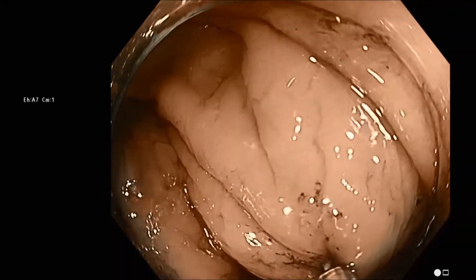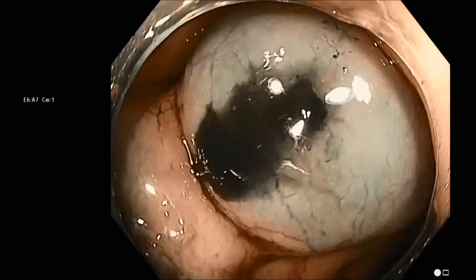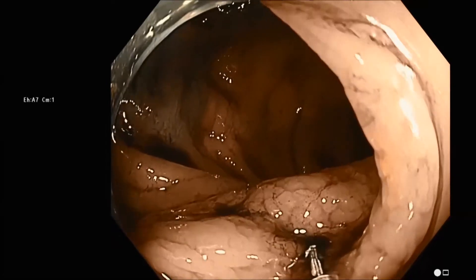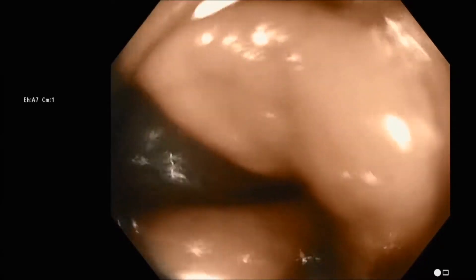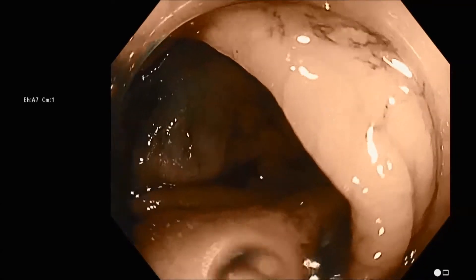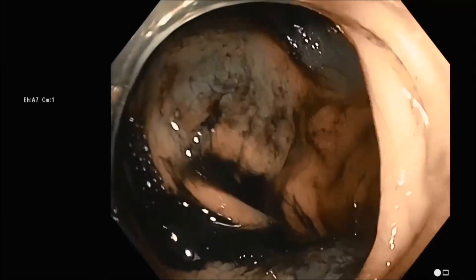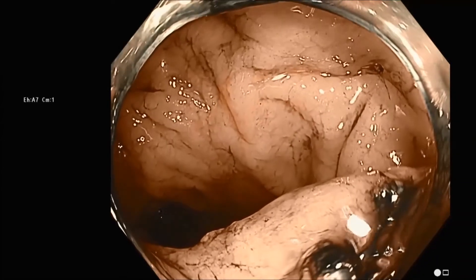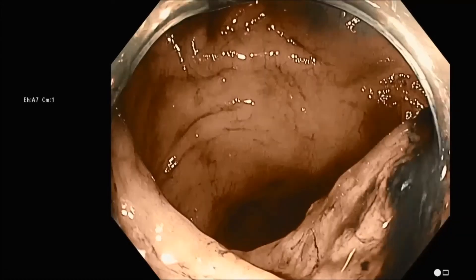Once we're finished we will take a photograph of the tattoos — hopefully the tumor will be visible. We're now going back to our initial saline blebs and getting back into those to put 1 cc of Spot into each. We're going to document that we have injected 4 mLs of Spot in four quadrants immediately distal to the tumor. That will be all the documentation needed to make sure the correct segment including the tumor is removed at surgery. Proper technique and location for tumor marking.